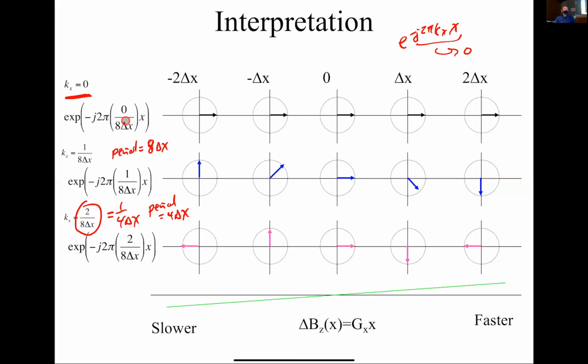So what you're actually going to do is instead of defining one kx, you're going to sweep across a certain range of them. Yes, exactly. We're going to have to acquire data in kx. So 1 kx is not enough. We have to have a lot of kx's. Yeah. So every kx sort of picks up a different sort of spatial frequency. But to make our image, as we'll see next time, we have to get information from all those different spatial frequencies.